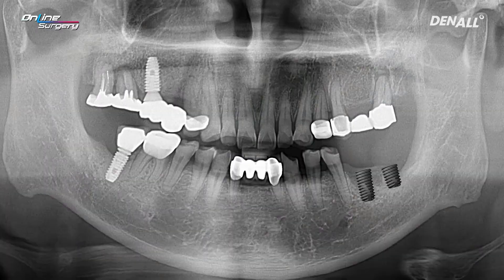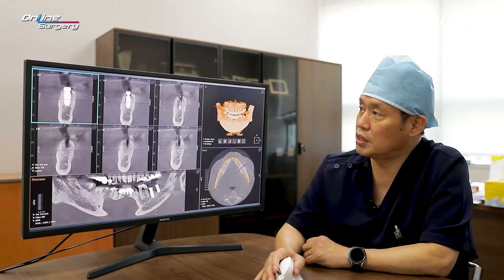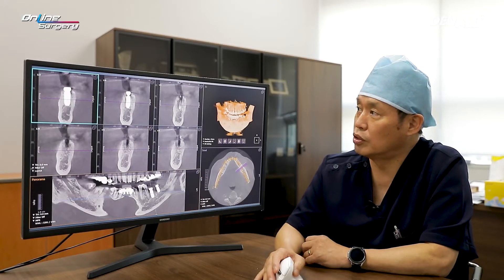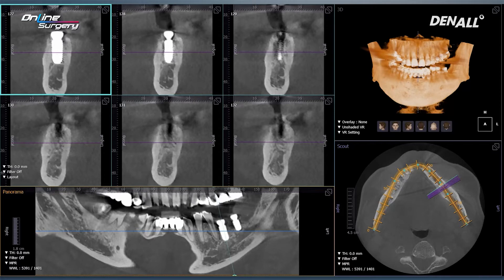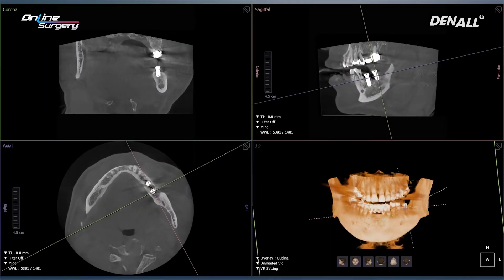Two implants are now placed. This is a post-op image — primary stability was good and healing abutments were connected. If you look at the post-op CT, in the case of number 36 it sufficiently engages the alveolar bone. In the case of number 37, the bone is not fully formed, however you can see that the implant has been placed as planned.